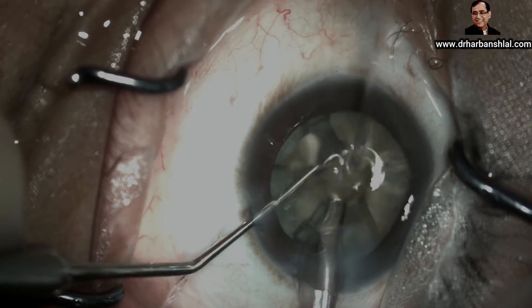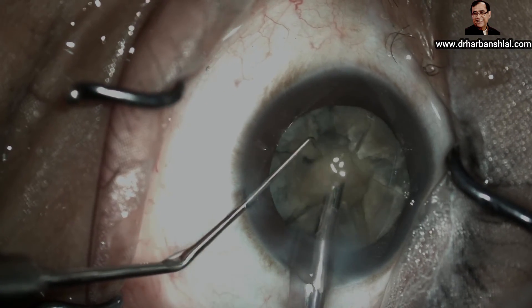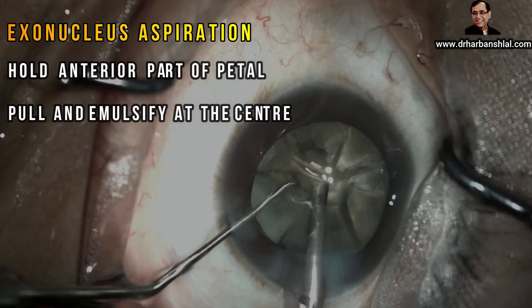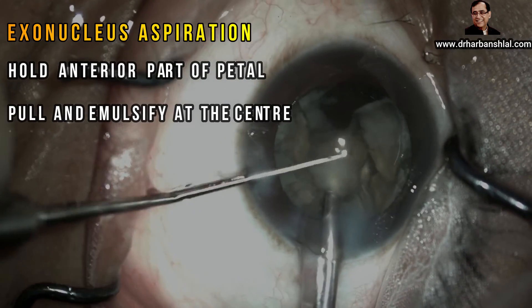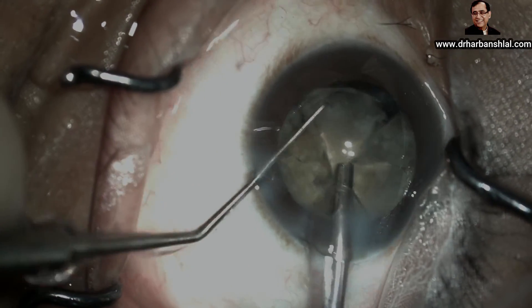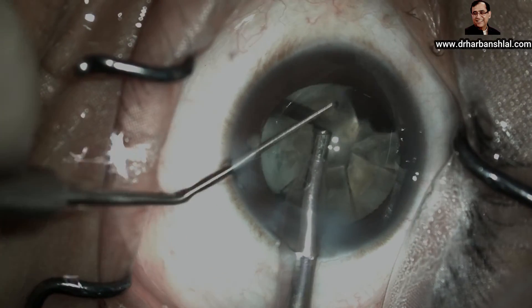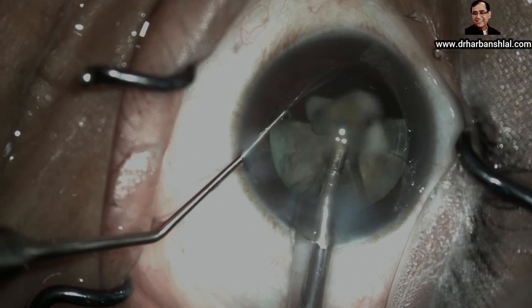This is far away from the cornea. Once the endonucleus is completely emulsified in the central safe zone, we will start emulsifying the peripheral exonucleus, which is now very easy to emulsify. Removal of the endonucleus creates a lot of space in the center for safe removal of the exonucleus. Though these petals of the flower are attached at the center, they pose no problem and get separated easily. Hold the anterior part of the petal, pull it into the center, and emulsify there.